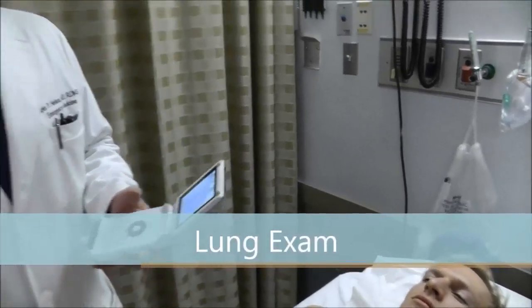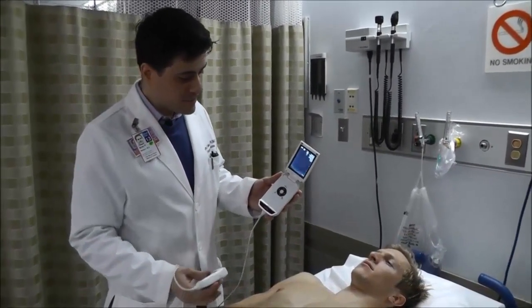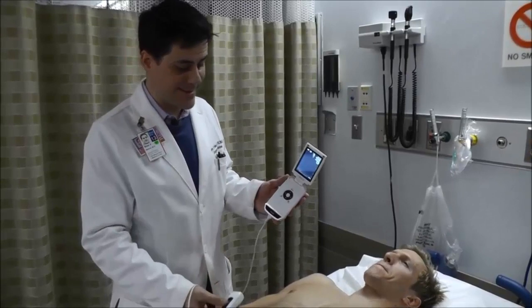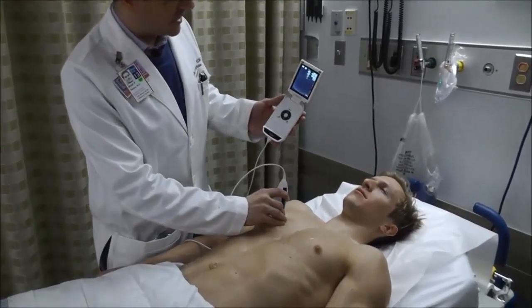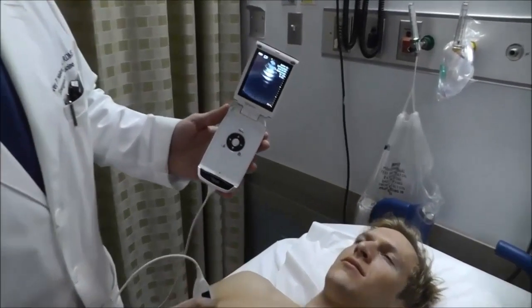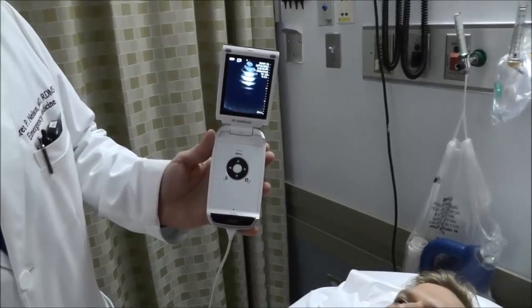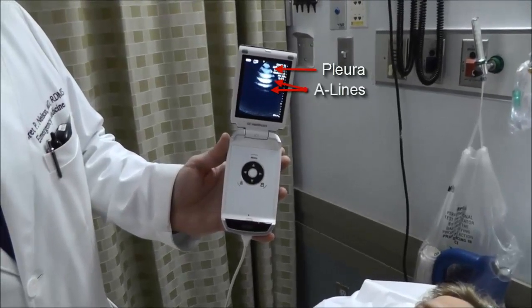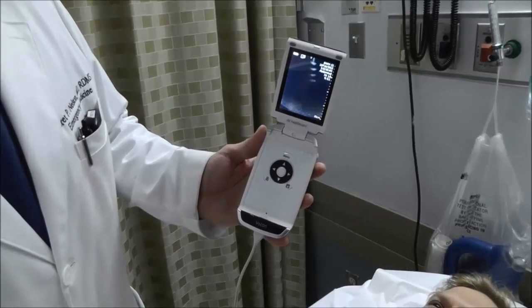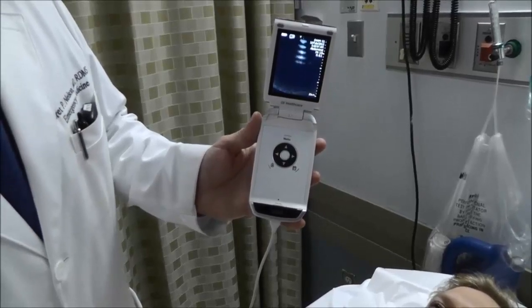The next view is the lung. For the rest of the studies for the entire ASM course, we're going to be in abdomen mode. To look for B-lines and A-lines — signs of normal lung and pulmonary edema — we place the probe on the anterior wall of the chest until we start to see pleura and reflections. Here we can see A-lines: the first horizontal curved line is the pleura, and the remaining lines beneath it are reflections of the pleura. This is normal lung with no pulmonary edema. We perform the exam on the other side as well, again seeing A-lines, with the top line being pleura and the remaining lines being reflections.